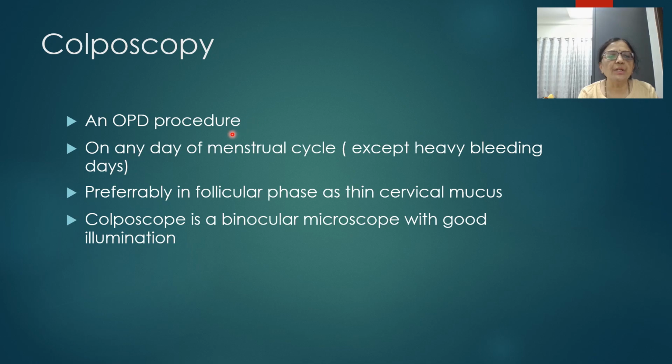Colposcopy is an OPD procedure. It can be done on any day of the menstrual cycle except on heavy bleeding days, during menstruation, where visibility of the cervix will be a problem.